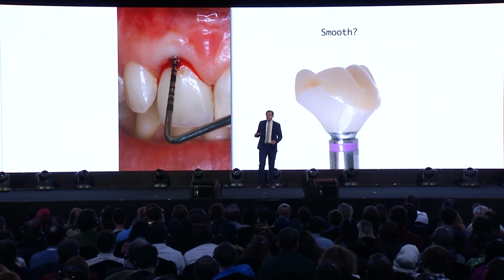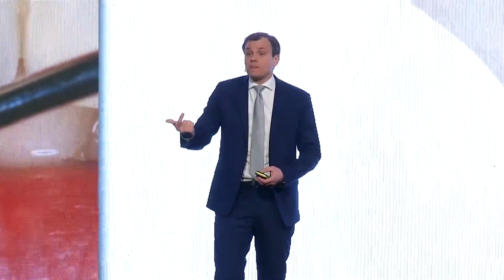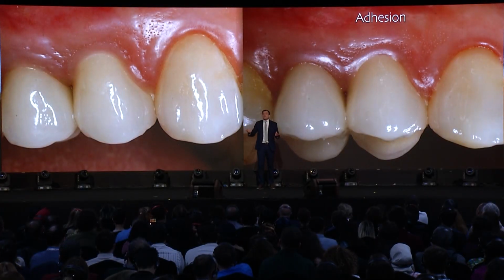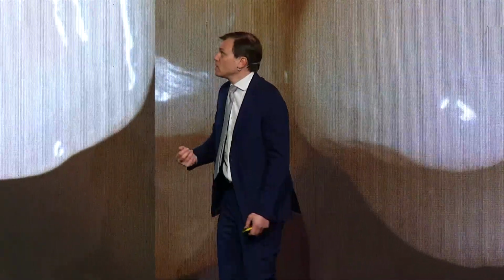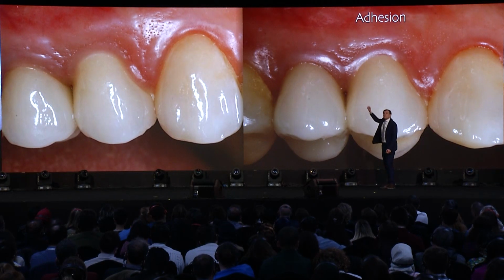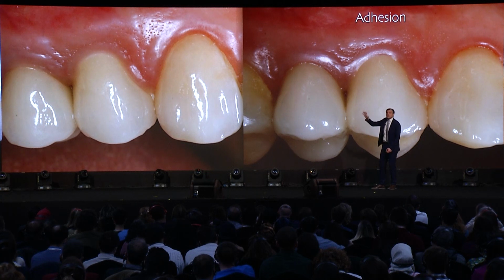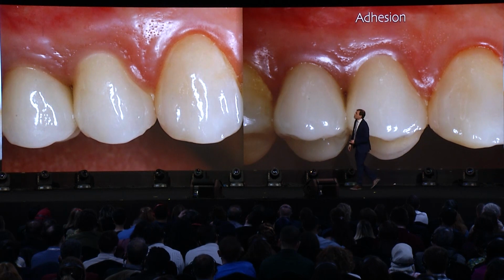But to finalize the understanding of why we need it, we need to talk about fibroblasts. Remember when I told you that actually we do not have contact of fibroblasts to zirconia when you put the restoration? So what does the zirconia have contact with if it's not fibroblasts? Remember this ideally developed peri-implant integration? Then there is no difference, it even looks better around the implant than the tooth.